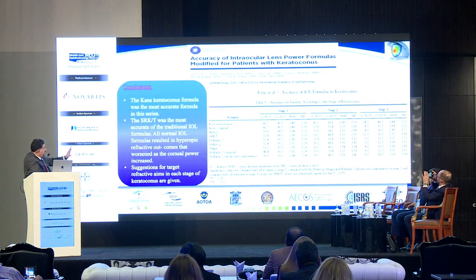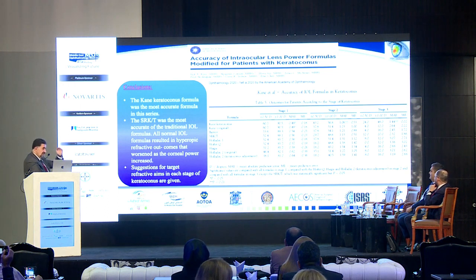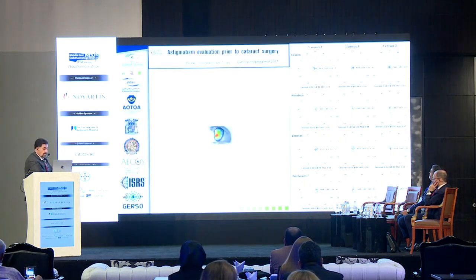So in this very study, from 2020, the last study about cataract with keratoconus, they said that the Kane keratoconus formula was the most accurate formula in this series. After the Kane formula, you can go for SRK-T. But the Kane, then the SRK-T, give the best results post-operatively.